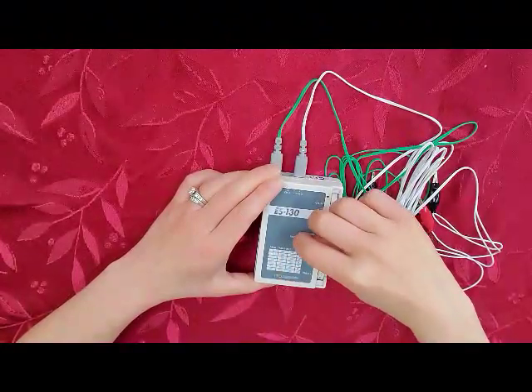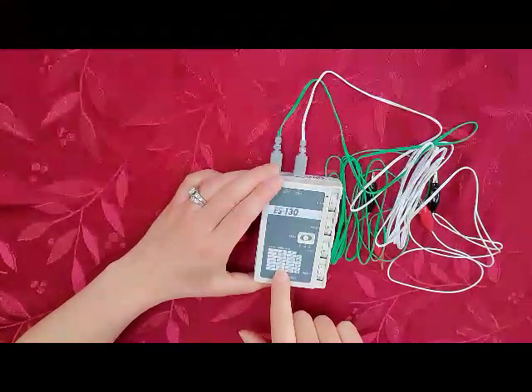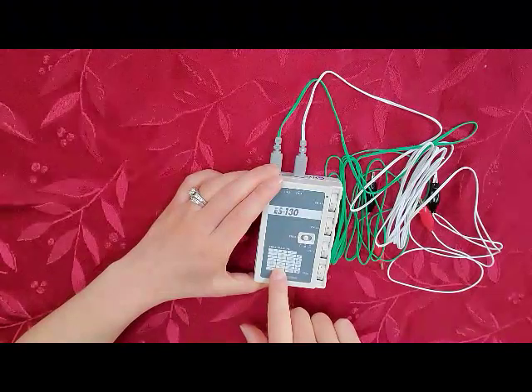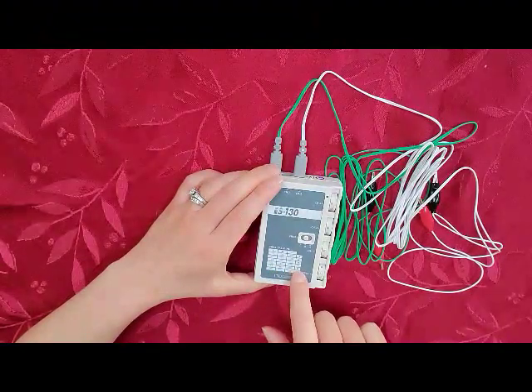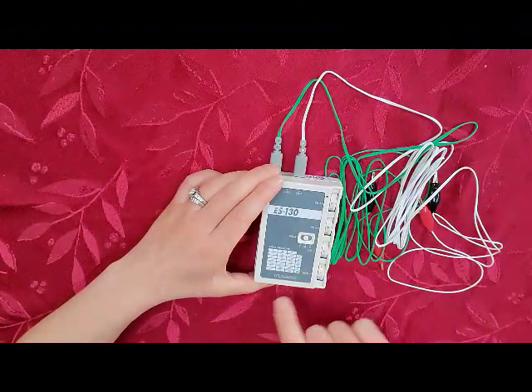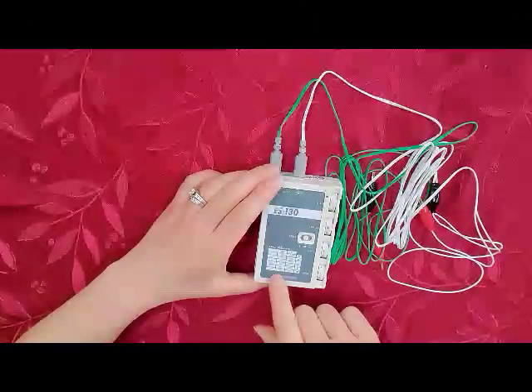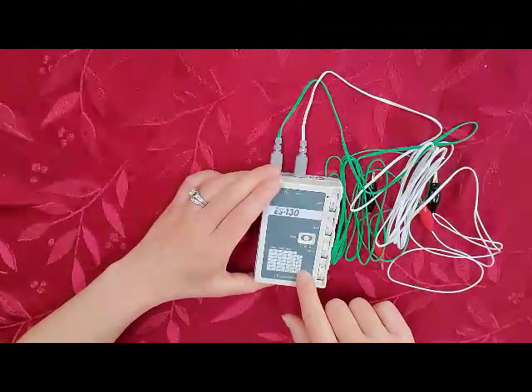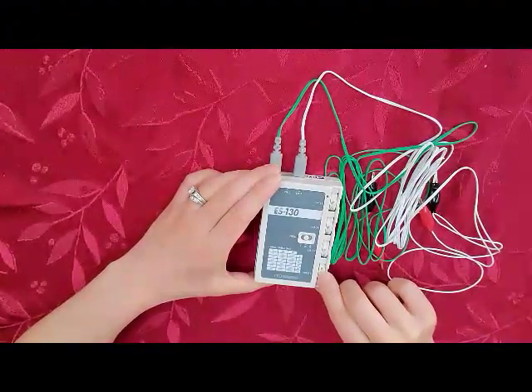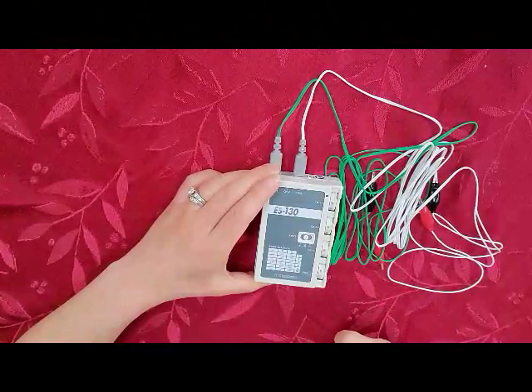So we're going to move that tab to the M position, and we know that 100 Hz sits between the 80 and 150. If we follow that column over to the right, we know that our setting needs to be between 8 and 10. So we go back to our frequency dial and make our adjustment. Now, that 100 Hz is probably going to be a bit closer to the 8, so probably somewhere around 8.25. So we're going to roll that dial up to about 8.25 or so.